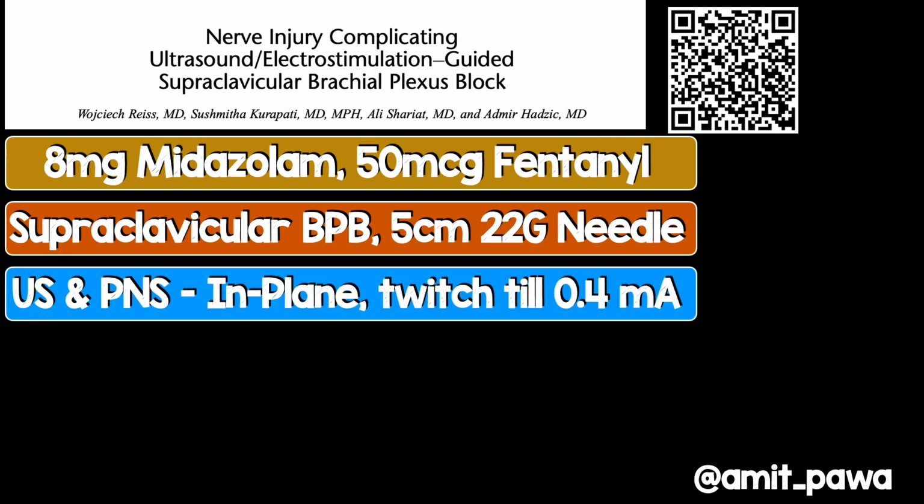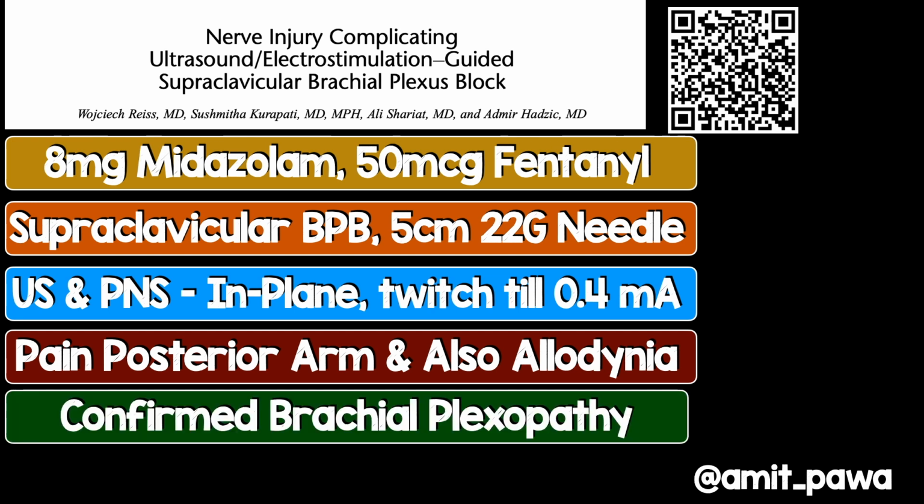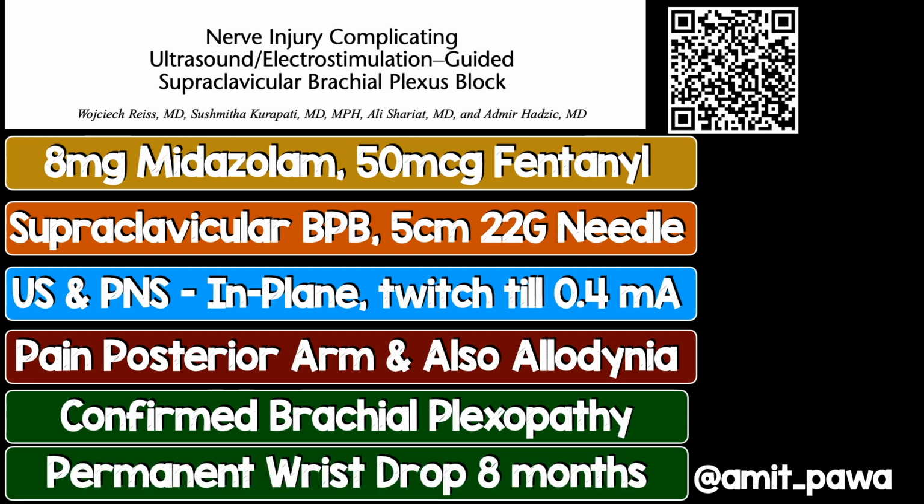They used an ultrasound and peripheral nerve stimulation technique in plane and aimed to stop when they got twitches at 0.4 milliamps. Post-procedure, however, the patient developed pain in their posterior arm and allodynia, and they got confirmed brachial plexopathy, and they had a permanent wrist drop for 8 months. So this is clearly not an ideal outcome, and it showed that actually using ultrasound and peripheral nerve stimulation did not prevent harm when they were both used together.